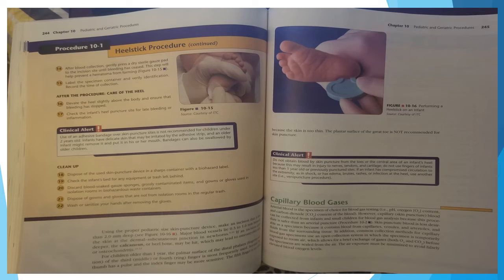Capillary blood gases. Arterial blood is the specimen of choice for blood gas testing.